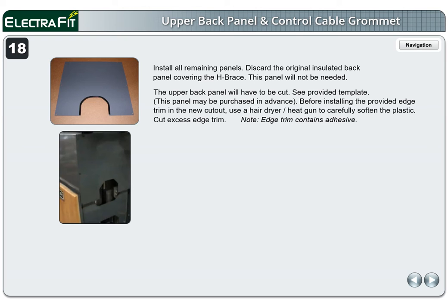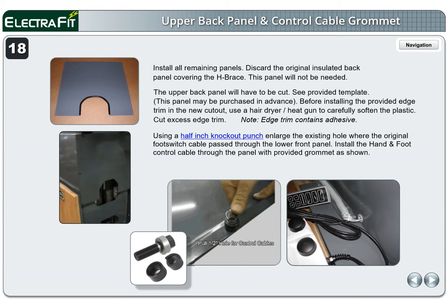This panel may be purchased in advance. Before installing the provided edge trim in the new cutout, use a hair dryer or heat gun to carefully soften the plastic. Cut excess edge trim. Note: edge trim contains adhesive. Using a half-inch knockout punch, enlarge the existing hole where the original foot switch cable passed through the lower front panel. Install the hand and foot control cable through the panel with the provided grommet as shown. The grommet is installed from the inside of the metal panel.